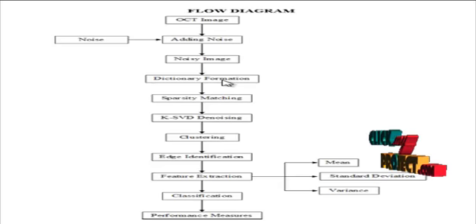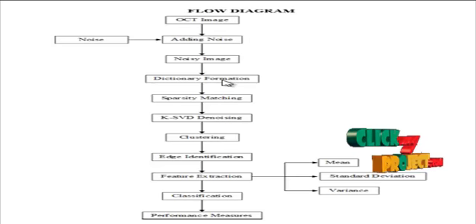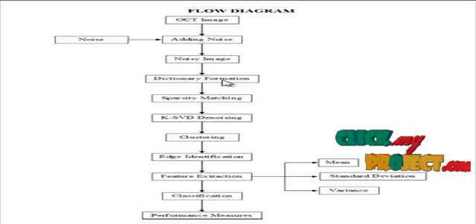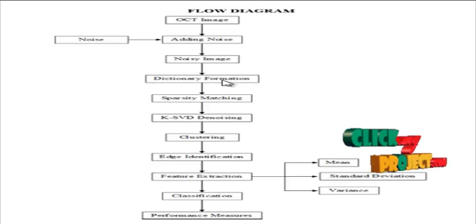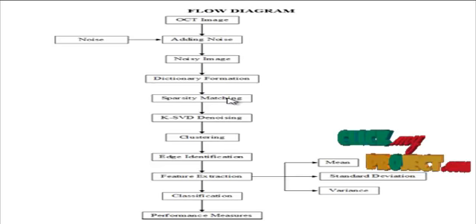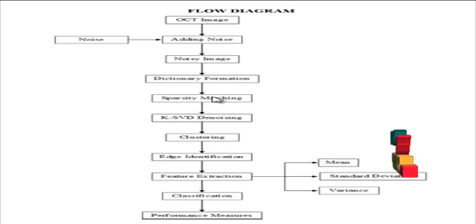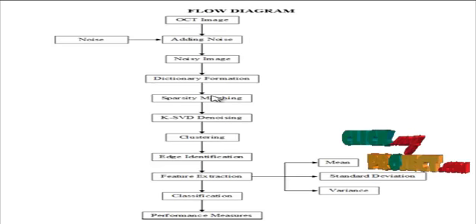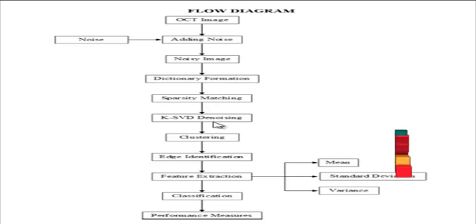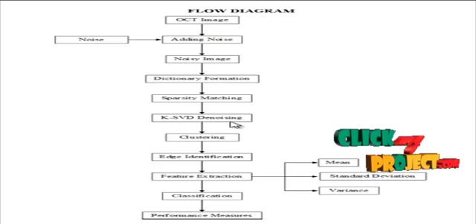The sampled images were divided into 8x8 patches. In the constraint optimization process, the relationship between the original pixel information and the magnification rate can be identified. From that, the sparse matching process is employed. In the sparse matching process, the identified noises were matched, resulting in the exact identification of the noisy pixels in the input images. Finally, the KSVD denoising process is employed.